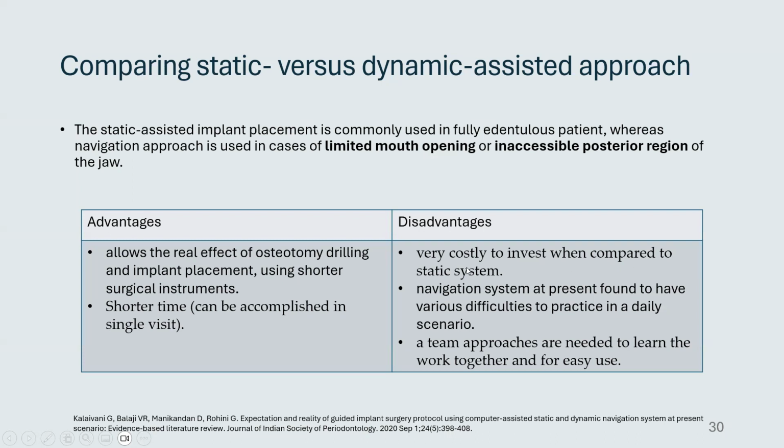The disadvantage is that it's very costly for investment when compared to static systems. These systems still have various difficulties to practice in daily scenarios, and a team approach is needed to learn to work together and for easy use. I mean, it's not easy, it's still complicated.